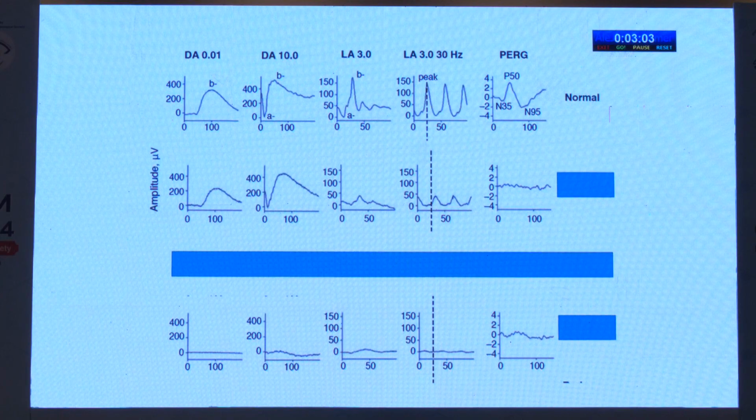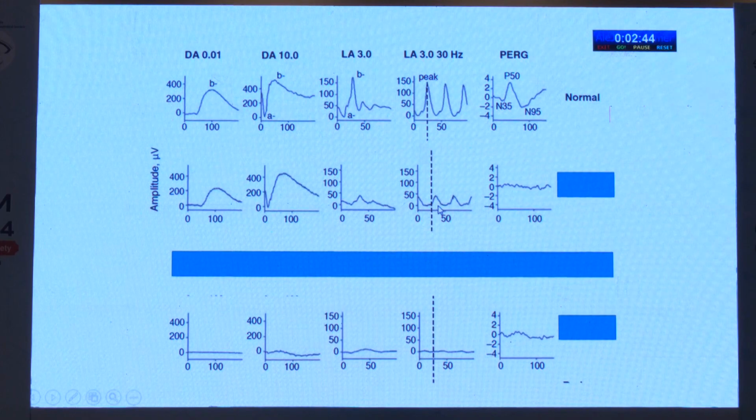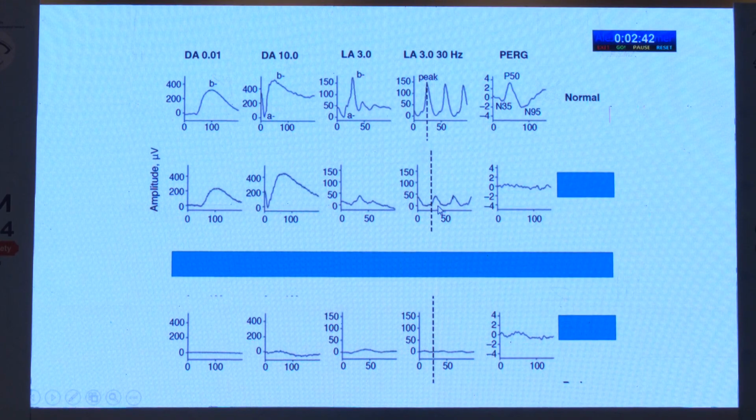Now let's see the ERG. This is the normal ERG in the upper panel, how a normal ERG should look. And this is the actual ERG of that patient. Here you see the dark adapted state has a good A waveform and B waveform. But compare the light adapted state, the 30 hertz flicker: here the waves are markedly diminished. So this is actually a cone dysfunction. By correlating, this ERG itself explains that the cone system is malfunctioning. So this is a case of cone dystrophy.